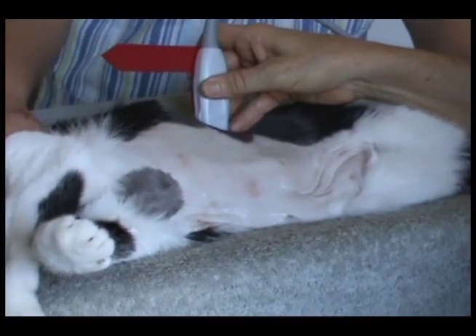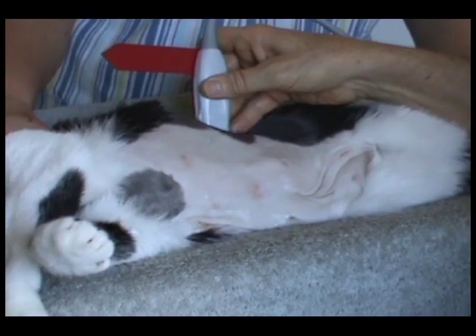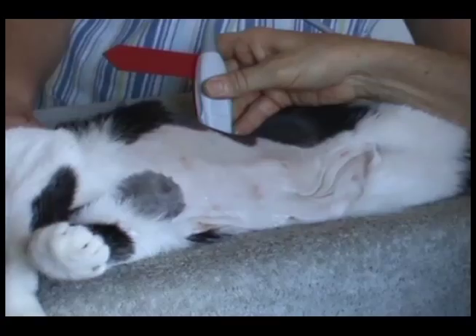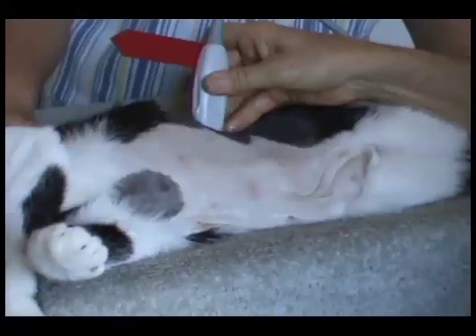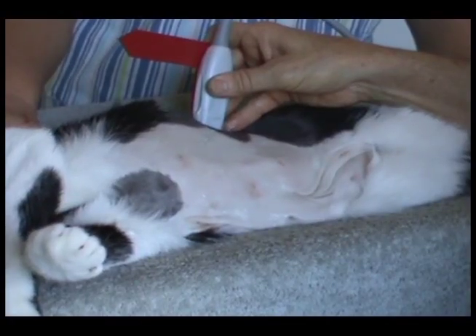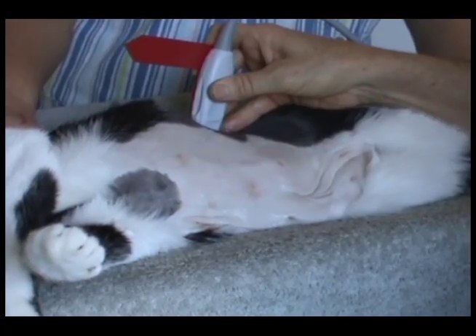There are a number of methods of finding the left adrenal which are discussed in the Finding the Adrenals DVD. We will discuss the left lateral sagittal method in this DVD. We will use a 16-pound cat for the left adrenal. Remember to keep the organ centered on the ultrasound screen to reduce artifact.